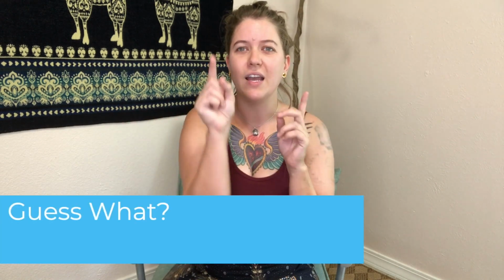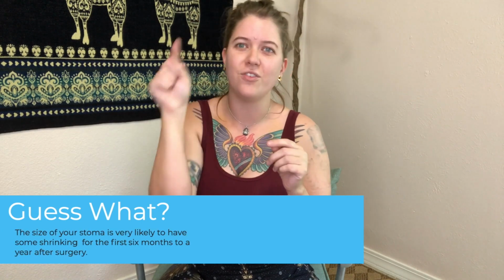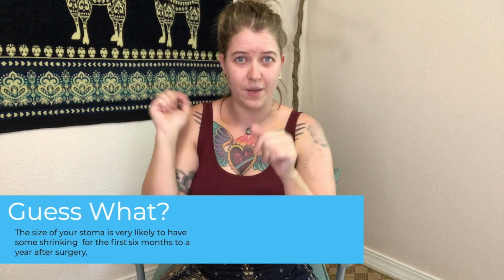The hospital also gave me a piece of clear plastic film. I thought that this was really great because of what we ended up doing with it. We took that sheet and did something called Kiss Your Stoma. You take the piece of plastic, put it up against your stoma and pull it off. What you're left with on the transparent is an outline of your stoma. Make sure you firmly press so it gets the entire width of your stoma. Then you use a Sharpie and go around and draw it out, and then you cut out that shape.